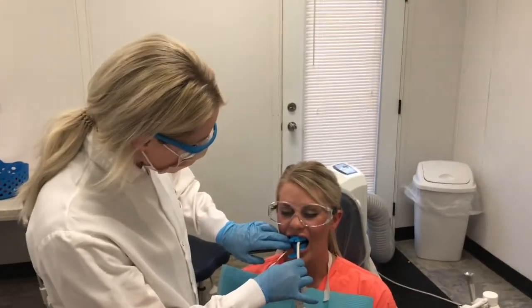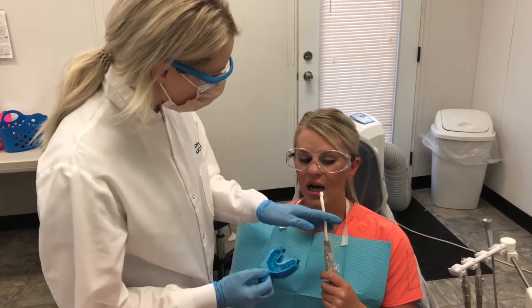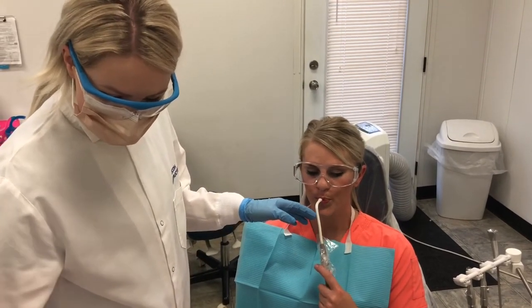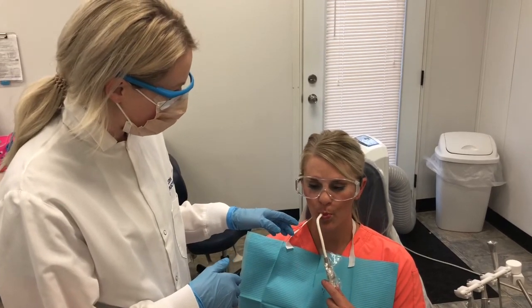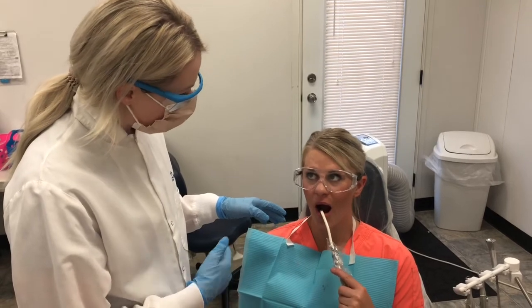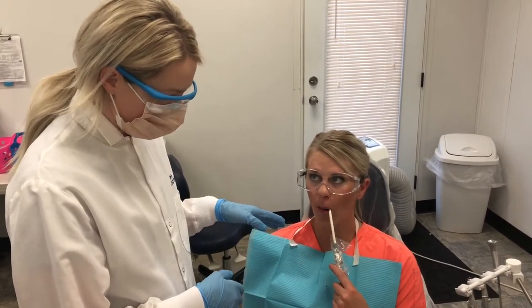At the end of the four minutes, you're just going to go ahead and remove the tray and have the patient close around the suction. Give them a couple of minutes to continue to close around the suction to clear out the fluoride. You'll also want to let them know to wait half an hour before eating or drinking anything following the tray application.